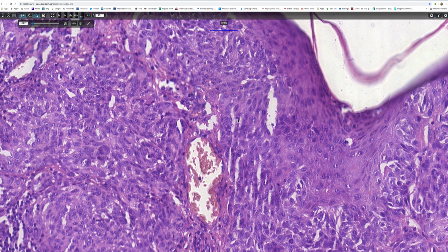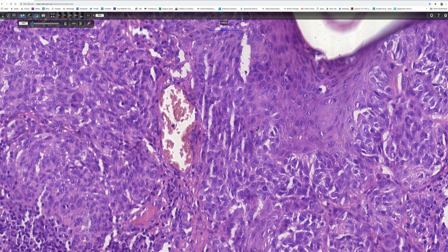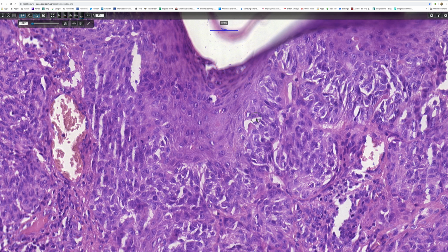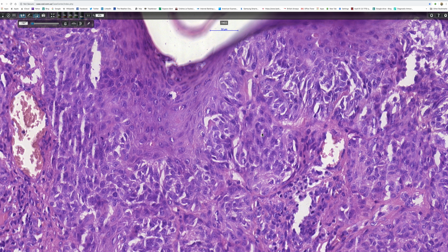And there's a possible mitosis there, somewhere near the epidermis. Whether that's junctional, I'm not sure. There's another one there, but I don't know whether that's in a keratinocyte or in a nevus cell, because there's obviously very marked epithelial hyperplasia. There's another one there. So there are lots of mitoses, but they're all at the top.